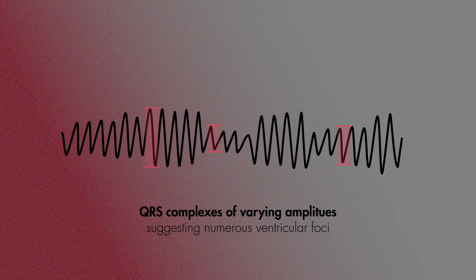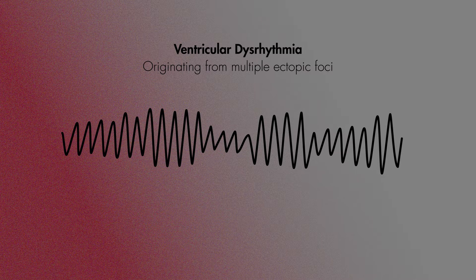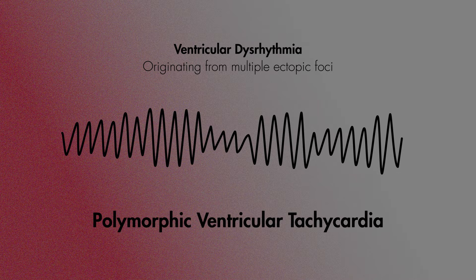Taking a step back, we could also see how these complexes have varying shapes and amplitudes. So putting this all together, hopefully you could get a sense that torsades is a ventricular cardiac dysrhythmia originating from multiple ectopic foci, or better described as a polymorphic ventricular tachycardia.